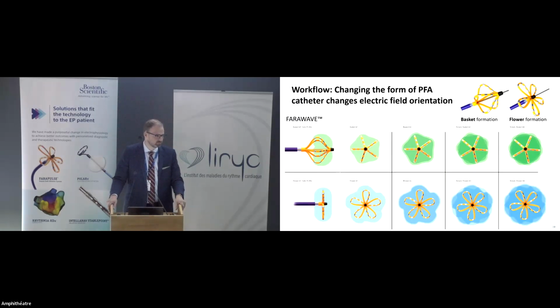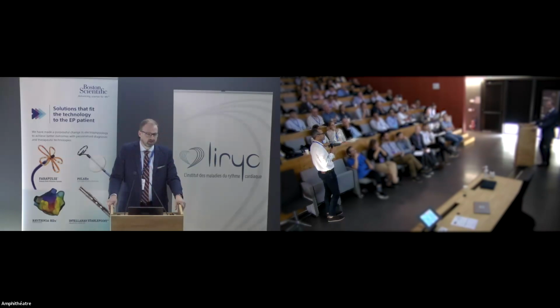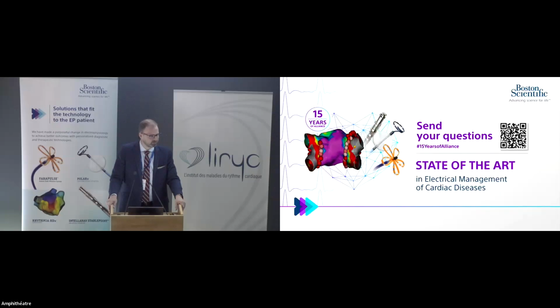Do you have reasons to believe that you have better efficacy with 31 millimeters versus 35 from an engineer standpoint? Yeah, not when positioned well. The catheters are designed to give you the same field and the same depth. Mechanically, the splines on the 35 are the same material, the same diameter. So if you're going to make a longer spline, it's going to be a little bit easier to move it. So if somebody was using a 35 and it really shouldn't have been selected for that atrium because it's too small, or maybe they're not as skilled at manipulating the catheter, whether it's in basket or flower, those splines can move around and it's maybe slightly harder to get them evenly distributed.